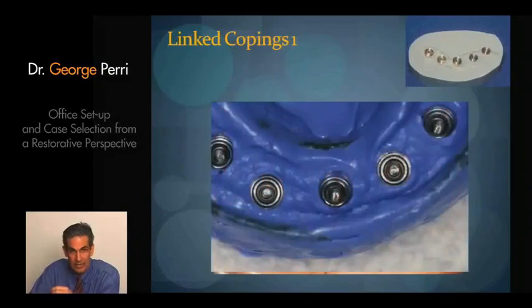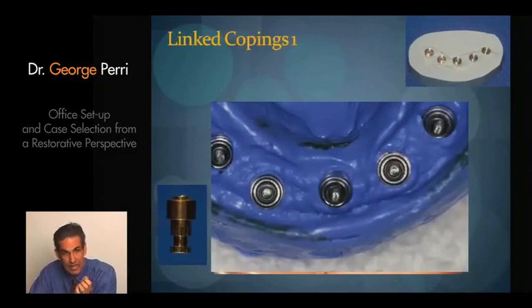After the material is set, you need to loosen each of the screws. You lift the impression out of the mouth, you turn it over, and you can actually see the underside of each coping, and you evaluate to be sure no impression material was between the coping and the abutment or the implant. If there is, that implies that that coping wasn't fully seated, and you really should reject this impression. We then can go ahead and take analogs.